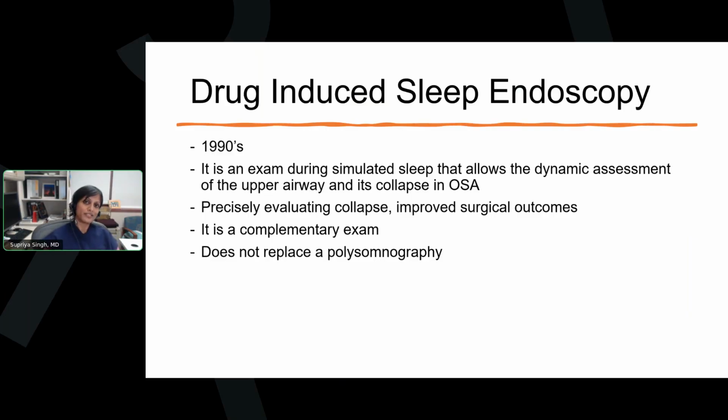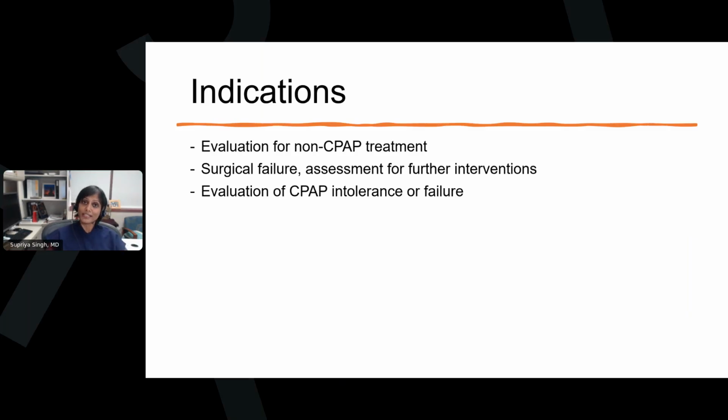One has to keep in mind this is just a complementary exam and it does not replace a polysomnography. So some of the indications are definitely, back in the day, to evaluate for surgical options of treating sleep apnea. Many times, patients failed these surgical therapies. As a result, we had to go back in, do another DISE to figure out which areas were no longer working. In today's day and age, we definitely utilize it for non-CPAP treatment, be it an oral appliance or the hypoglossal nerve therapy. And then there are certain patients who require very high pressures on their CPAP.